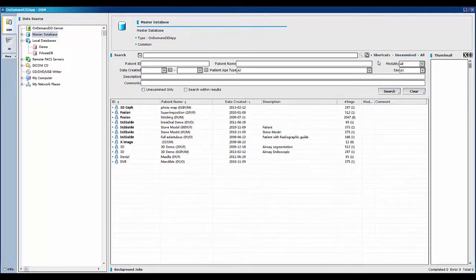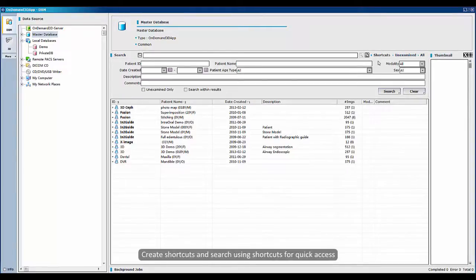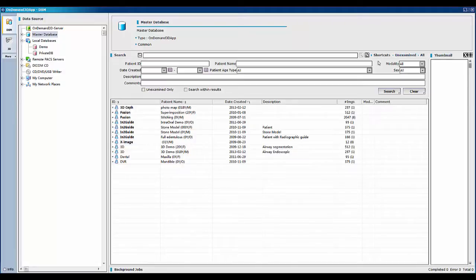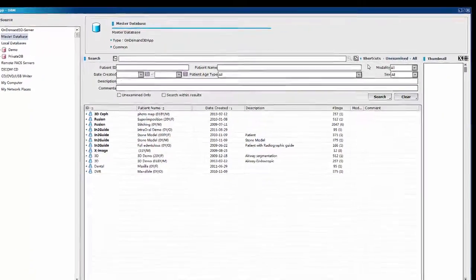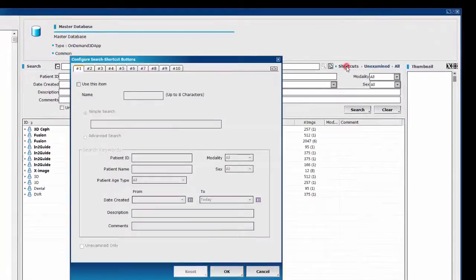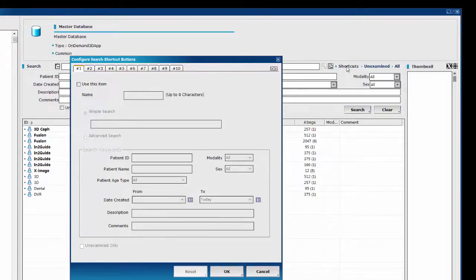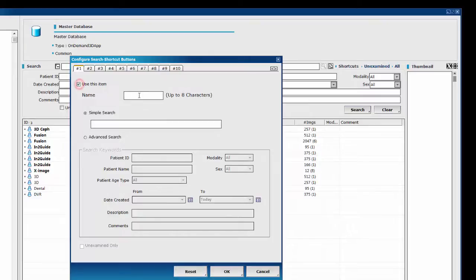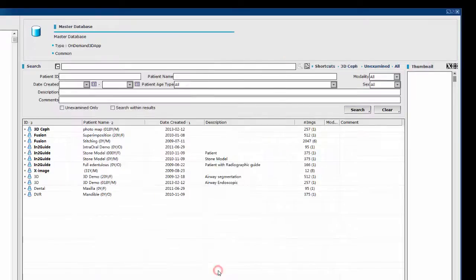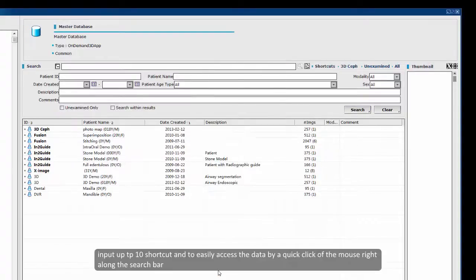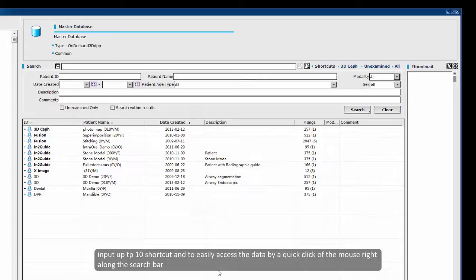Thirdly, you can also create shortcuts and search using shortcuts for quick access. Click the shortcuts icon and then input shortcuts information in the configure search shortcuts button window. With this function, you are allowed to input up to 10 shortcuts and to easily access the data by a quick click of the mouse right along the search bar.